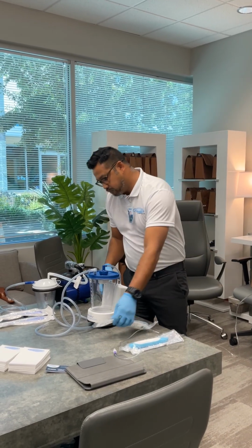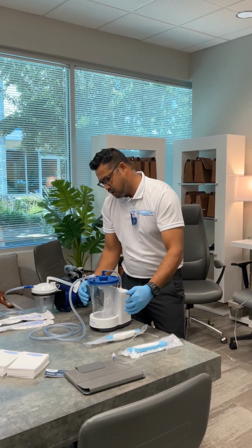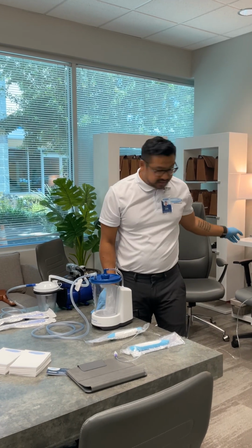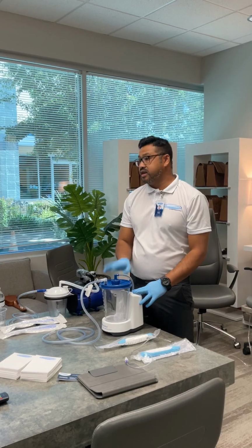Normally we dispense a little privacy guard. It's a piece of paper that just covers the canister so people don't see what's in there. For whatever reason, it didn't come in this kit, but normally we send it out. That's really all it is, just urinary drainage.